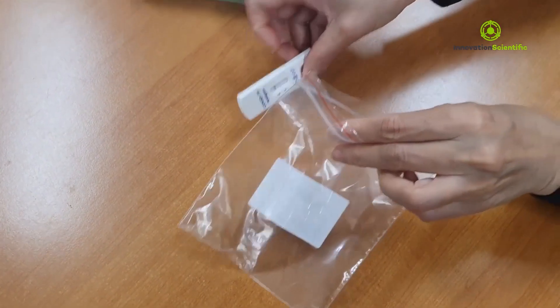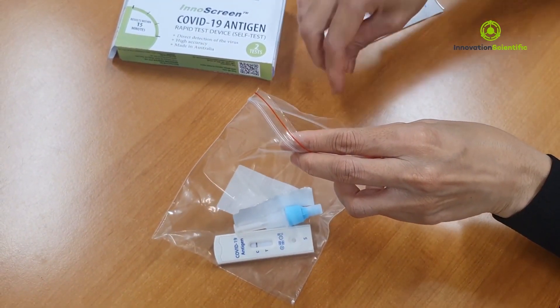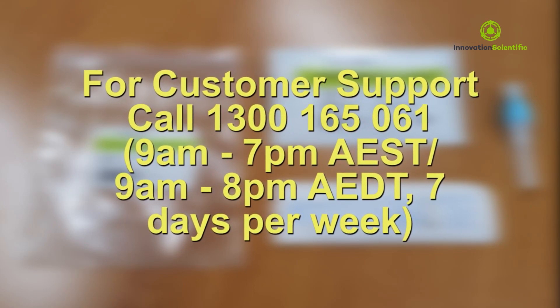After reading the result, place all the components in the plastic bag provided and dispose into a general waste bin. If you need any support, you can call the helpline provided in the instructions for use.